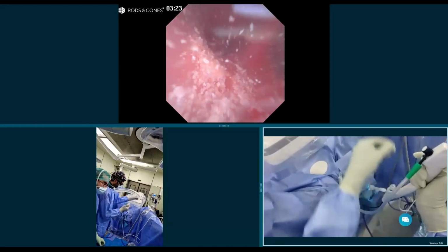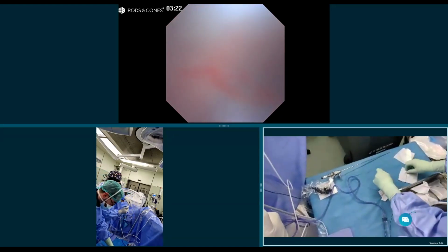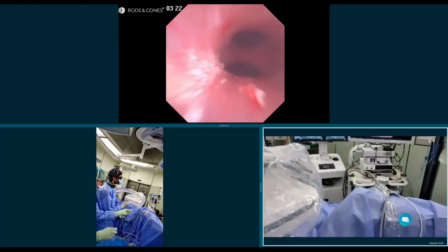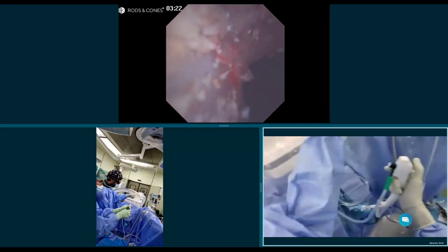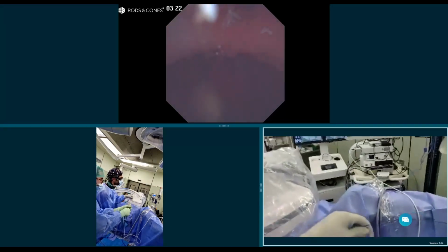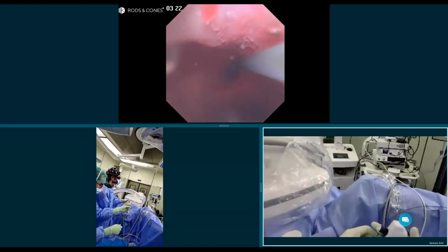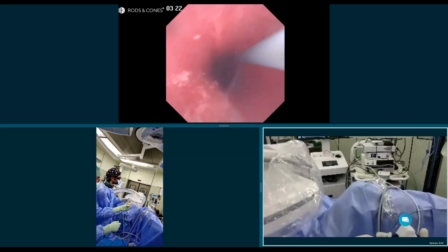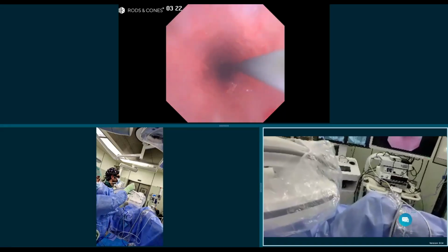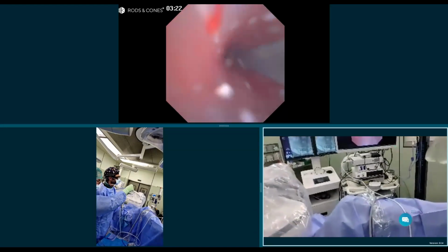Okay, I'm going to remove finally my fiber. We put it into the exactly so it doesn't bother. I'm going to put my guide wire in the upper pole. Remember you have to wet the hydrophilic guide wire always. It was very good to have the scope. It was very handy. It improved the maneuverability, and the vision was kept all the time. You can see the excellent digital imaging. You can check the ureter always. There are no problems with it at the end of the procedure. It was great.